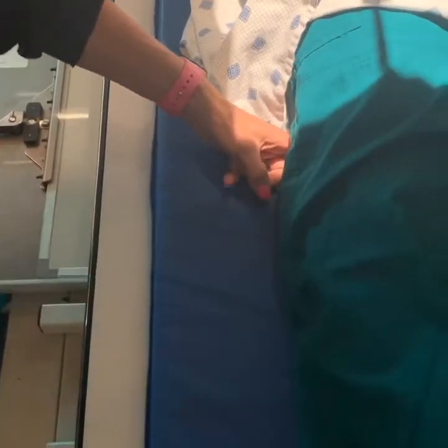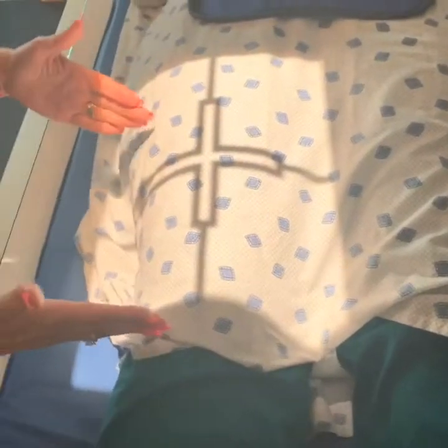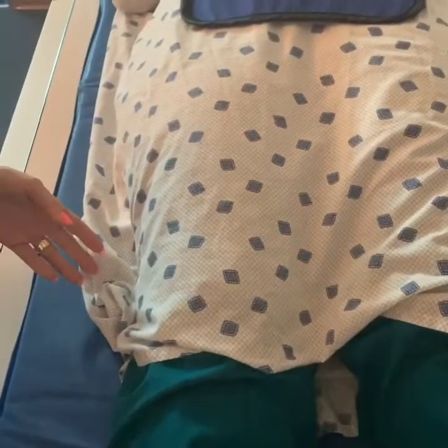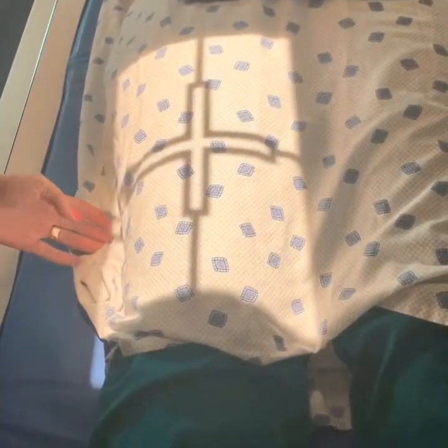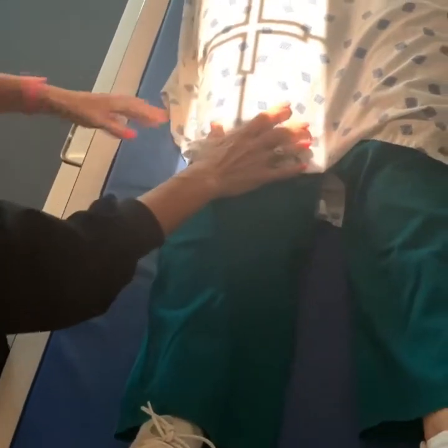So that is perfectly fine right there. And so there is really nothing special with the distal femur. The central ray is just including that and then in the middle, and your bucky aligned. And then the only thing we do is collimate side to side. And we have to make sure that we get a true AP of the knee, so we roll the lower extremity in about 5 degrees so that the knee is perfectly AP, just like when we do an AP knee.